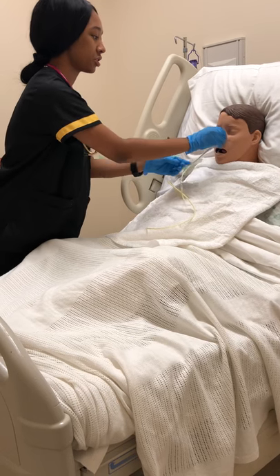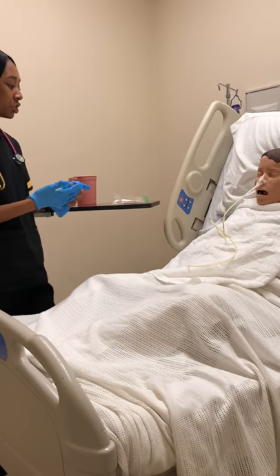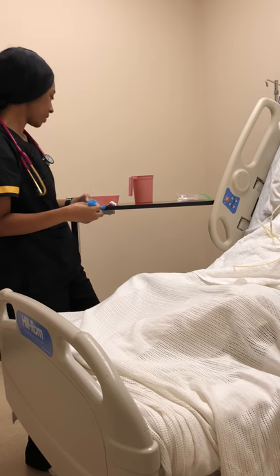All right, Ms. Johnson, now that the tube is secured, I'm just going to send you down to x-ray so that they can confirm the placement of the NG tube, just to make sure it's in your stomach before we start your feeding and everything. And I'll be back.